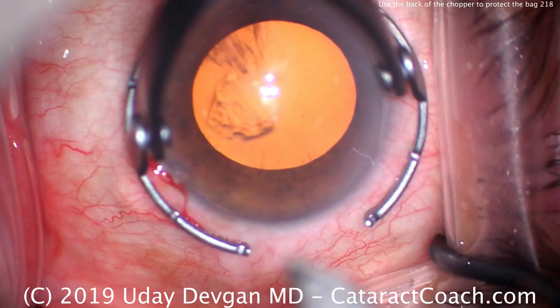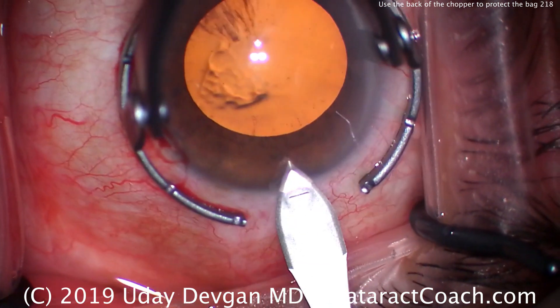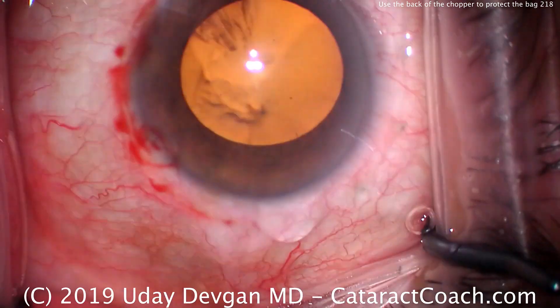We'll make our main incision. This eye is more prone to iris prolapse and things of that nature, basically due to the anatomy of the eye, so we want a nice incision like that.